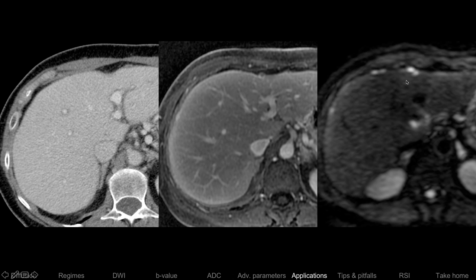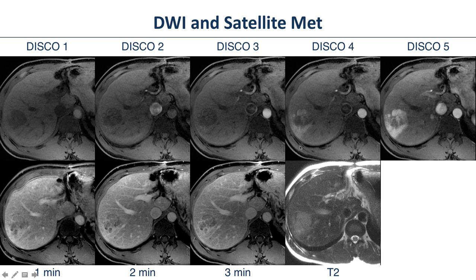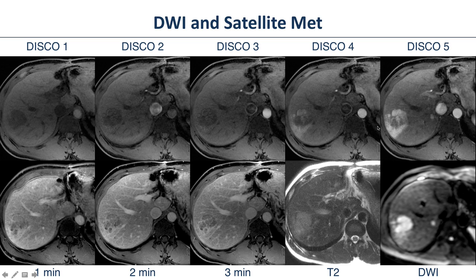DWI can also show cancers outside the liver — for example, serosal implants along the liver surface with appendiceal carcinoma. Once you see them on diffusion, you see them everywhere. Notice they can't be seen on CT done a couple days earlier. Also showing the DISCO technique from Stanford, brought to UCSD by Albert and Ryan, which allows imaging the liver every three or four seconds during the arterial phase. There's a cancer visible, and a second one becomes obvious on DWI.